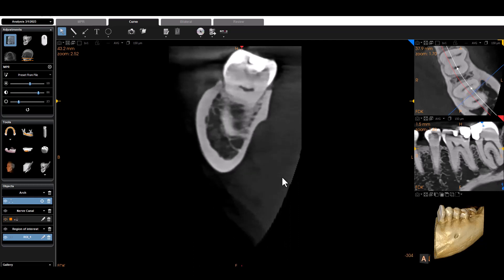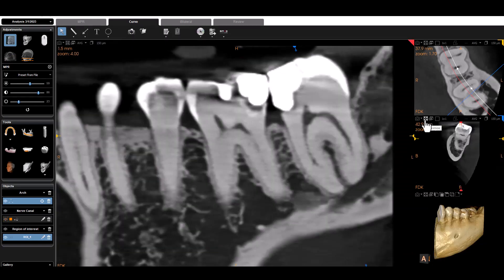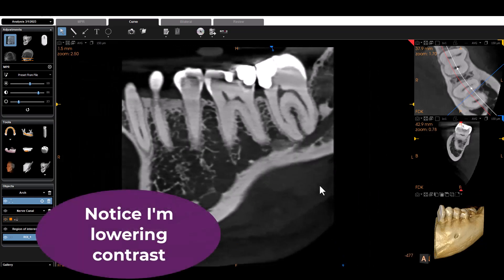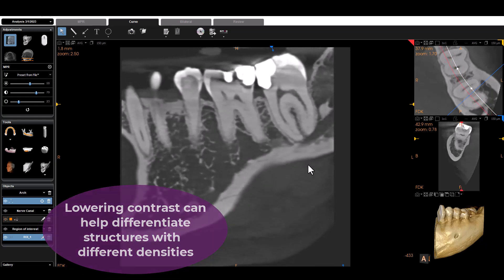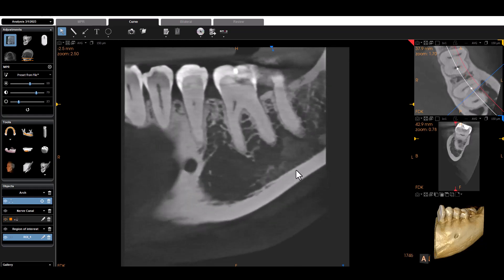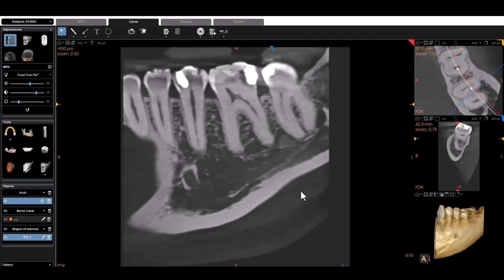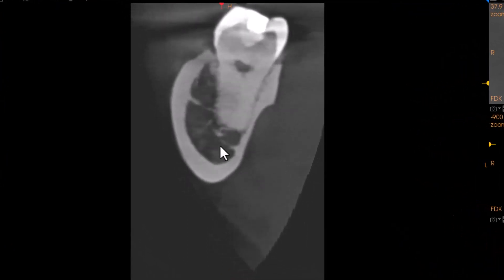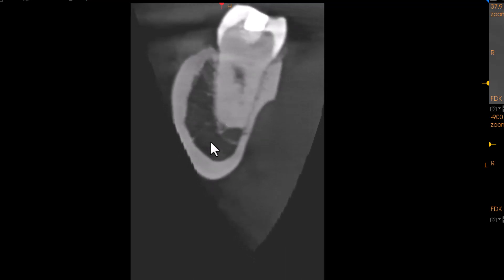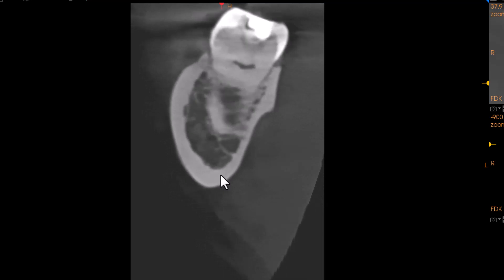So that begs the question — why was there such a large radiolucency on tooth number 18? Let's go back to the cone beam panoramic curve and zoom out. As I slice through, just look at how much marrow space there is — the nerve is right there — and you can see how that would present on the 2D image. Looking at the cross-sectionals, you can see the same thing: there's just tons of marrow space in that particular area of the mandible. That marrow space is presenting as a radiolucency on the two-dimensional image. Nothing was wrong with the patient — a nice application of using cone beam.